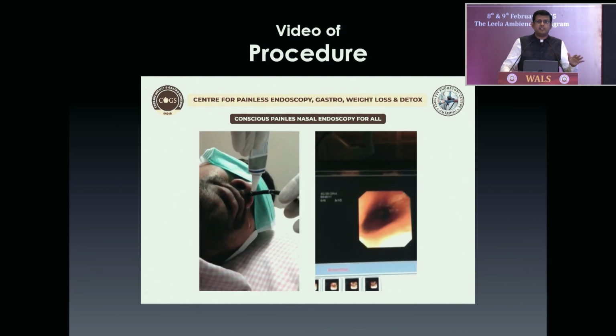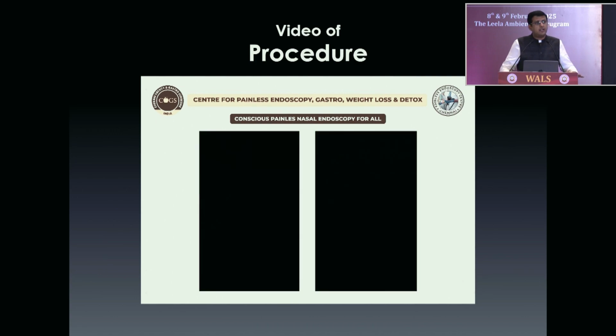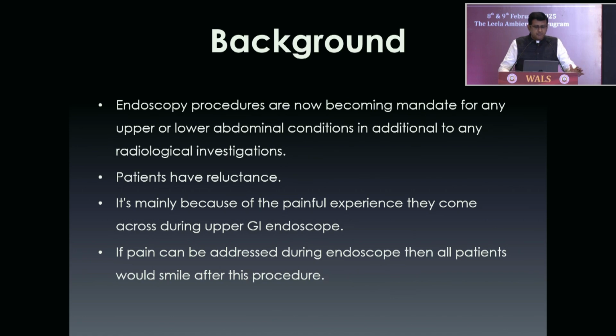Whether you do a nasal intubation or an oral intubation of the endoscope, it is all the same. But in a developing country, or a vast country like India, where endoscopy is an OPD procedure, this can be offered as the procedure of choice. Endoscopy is an instrumentation to look into the visceral organs to know whether you have any gastrointestinal complaints.